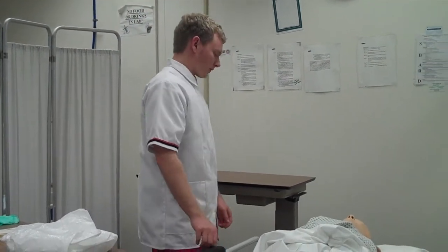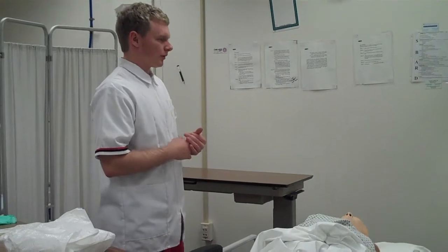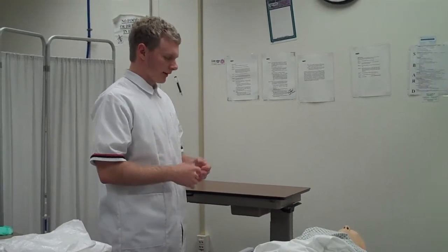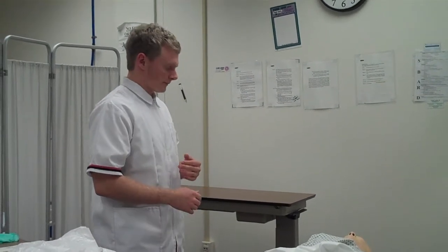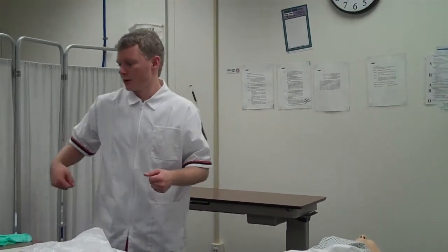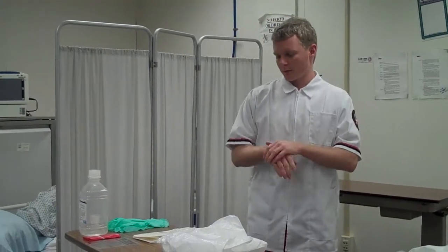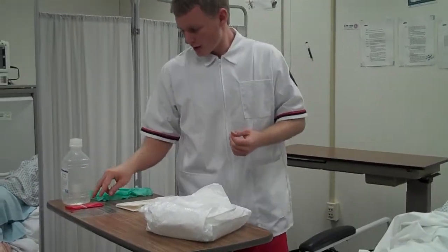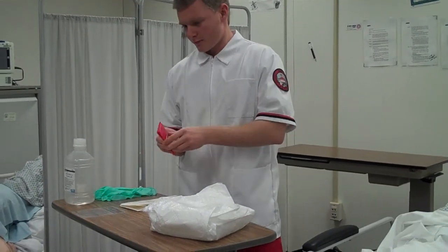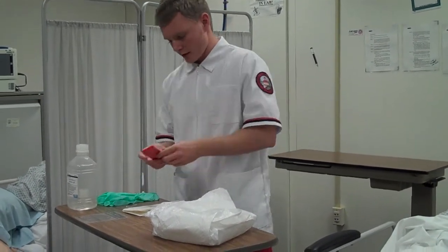So what we're going to do now is we're going to do a dressing change. We're going to take your old dressing off and apply a new clean one. Now I'm going to pull the curtain around, wash my hands, and I'm going to put my red bag over here.